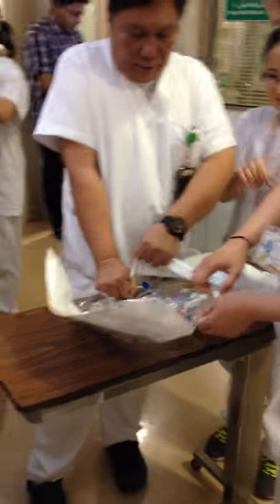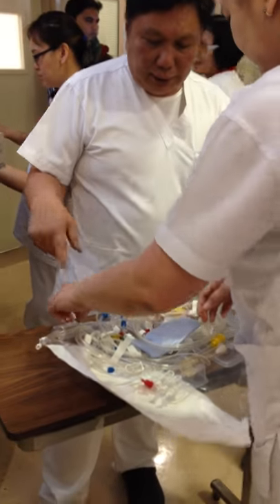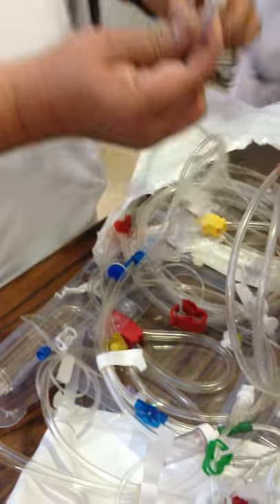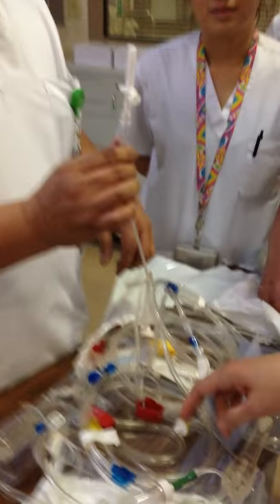Okay, I'll just send the link to follow the dialysis stuff, for those who are not here. And leave that in place, not closed. The most important thing is to close all the clamps here. This one is tight, close and tight. And here, this one should be tight. Why? We're not using the T junction anymore.